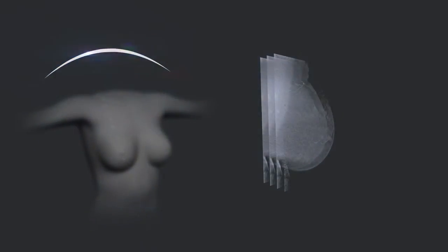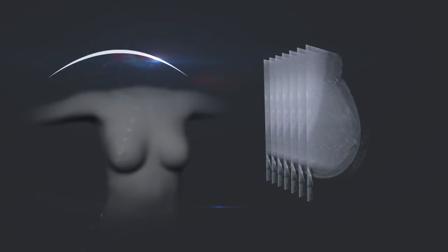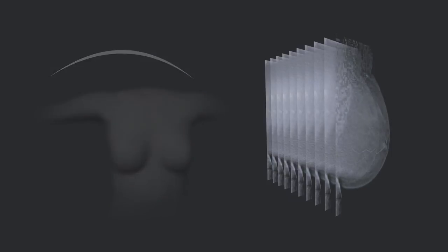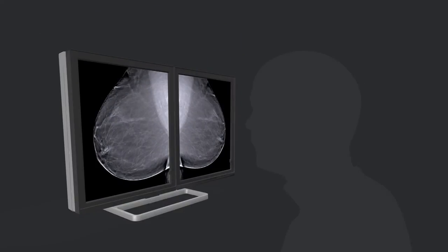3D imaging modalities take images of a breast from multiple angles. When viewing tomosynthesis breast images, radiologists browse through a stack of thin image slices in video or cine loop.